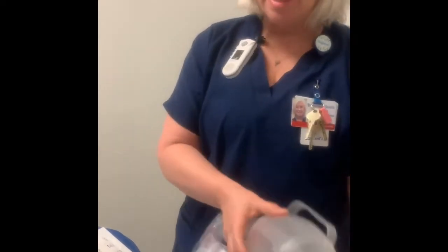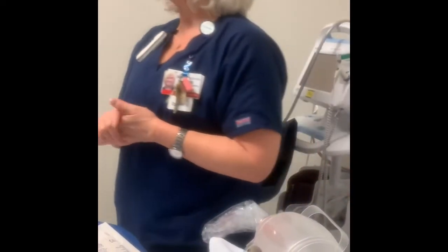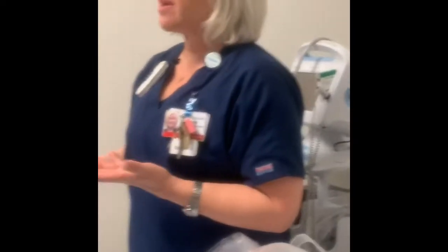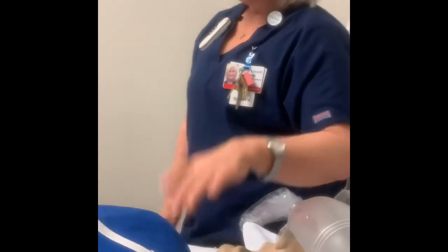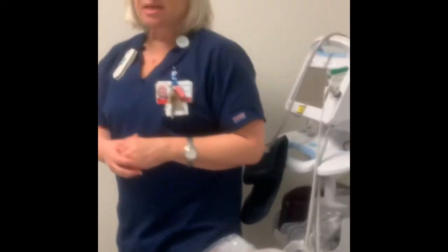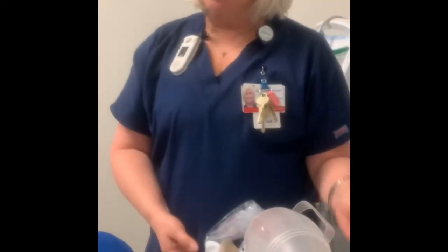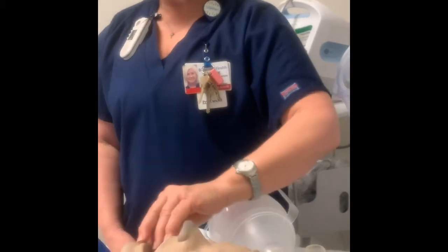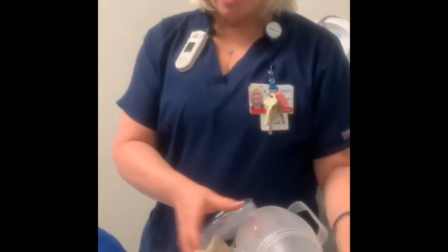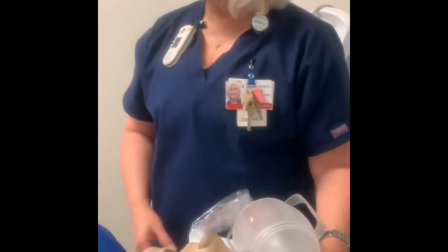They might be okay. If it's an established trach and it's been there, say, a year or two, which sometimes they do, especially if they've had their larynx worked on, then you can still ventilate them here. If I have a patient who needs to be ventilated on their stoma, and let's say maybe they've got a lot of stuff up into here, it's hard to ventilate them up here, I can still ventilate them in the stoma, but how am I going to do that?